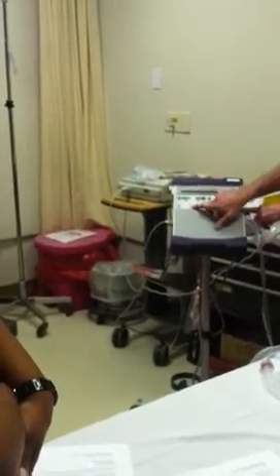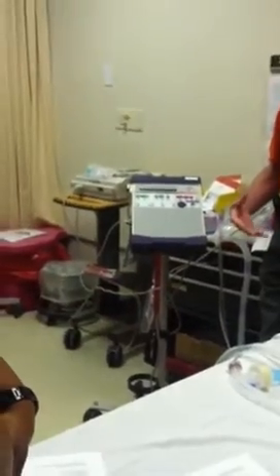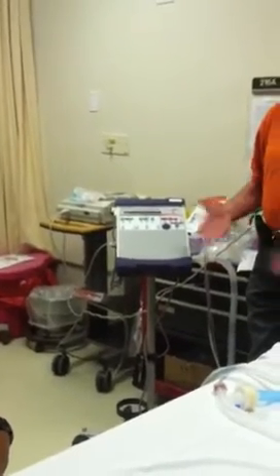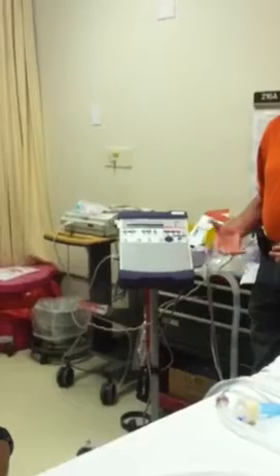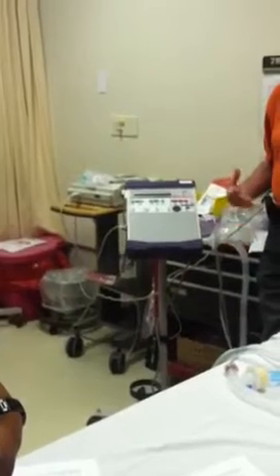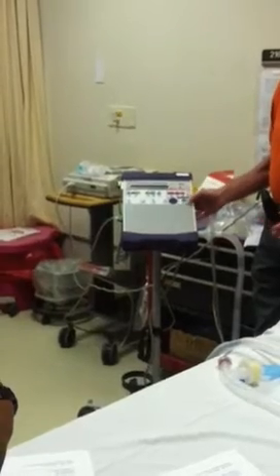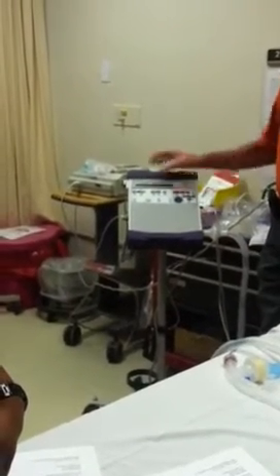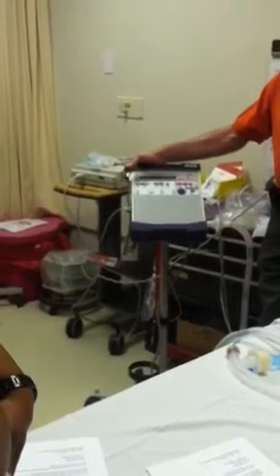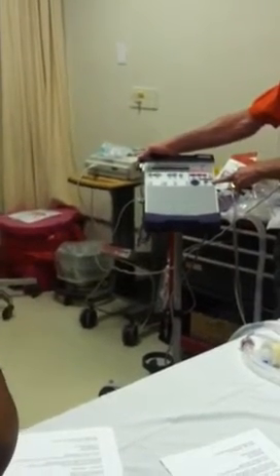And I'm going to switch. Usually, pressure support has to do with ventilation, helping the patient breathe easier. If the patient has an oxygenation problem where we've got them at 80% oxygen and their blood gases come back and their PO2s are still 50 or 60, we want to extend those lungs out a little bit further. The doctor might ask you to increase the PEEP. We normally keep the PEEP around 5. 10's not bad, but I have seen PEEP, if they're having a real oxygenation issue and we want to get their PO2s up a little better, we can increase that up to 18 or 20.